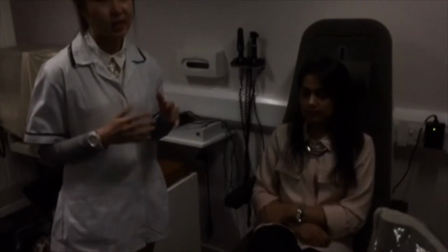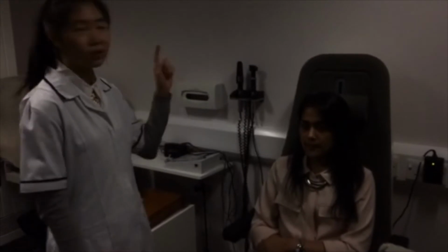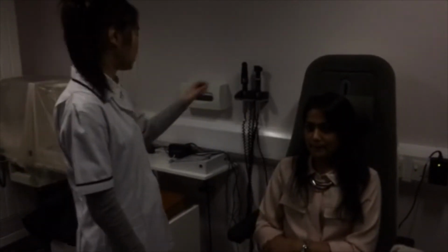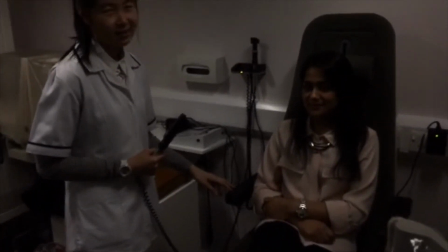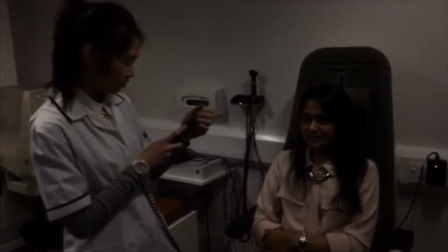Alright, I've just washed my hands before doing ophthalmoscopy, and then we will have to dim the room lights. Alright, and then now I'm going to raise the chair. Alright, Hafsa, could you please look at the top corner of the mirror?